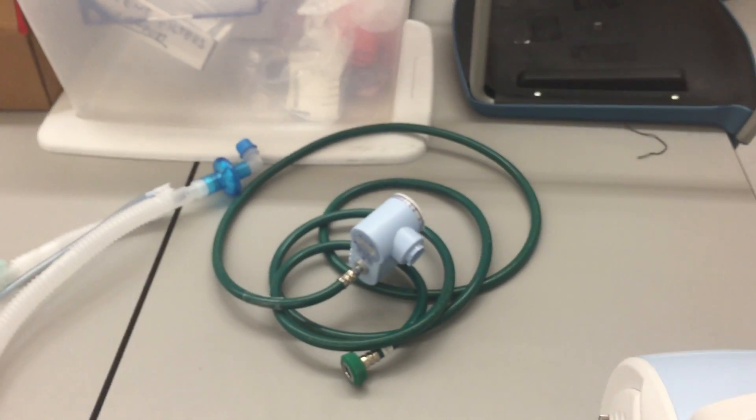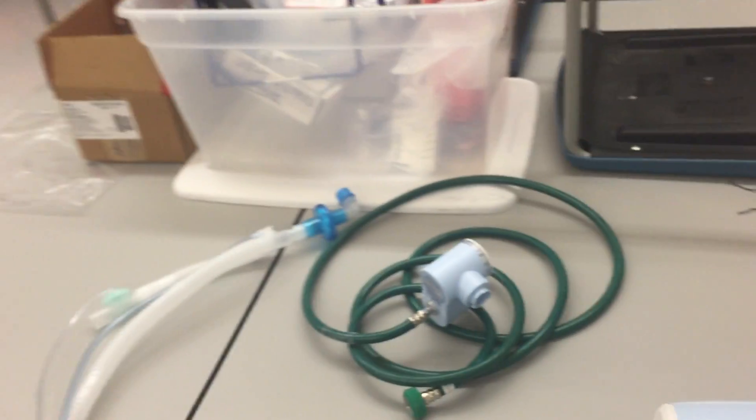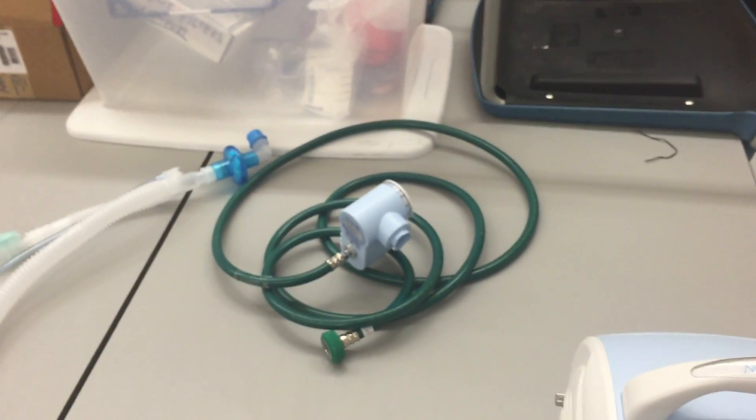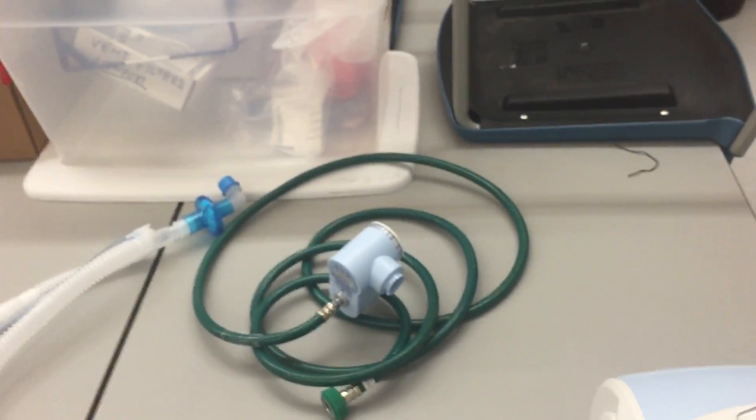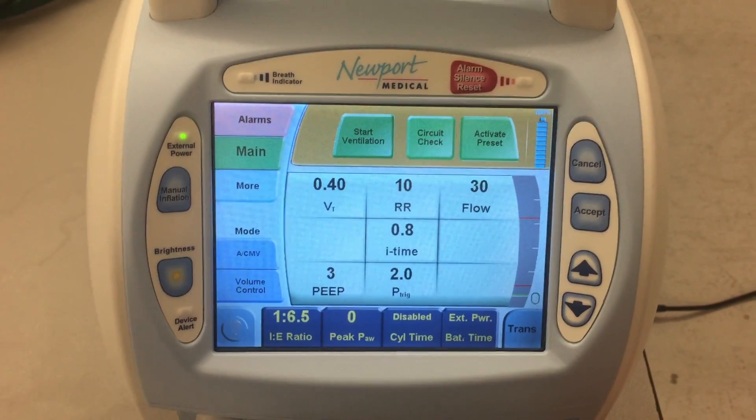Now, I'm not using the mixer, so I'll just be doing a room air setup, but we talked about how that goes and how we can attach that to a high-pressure gas source. So the ventilator is now ready to go — let's get in here a little closer.